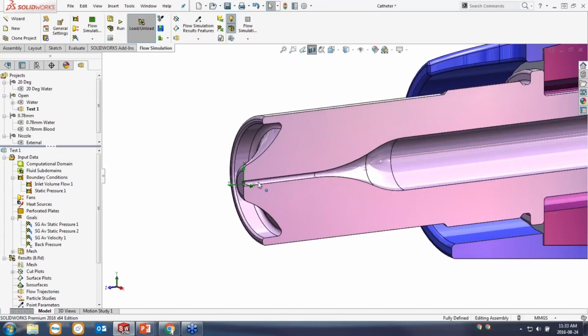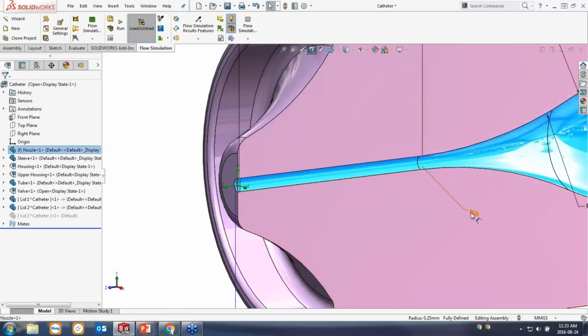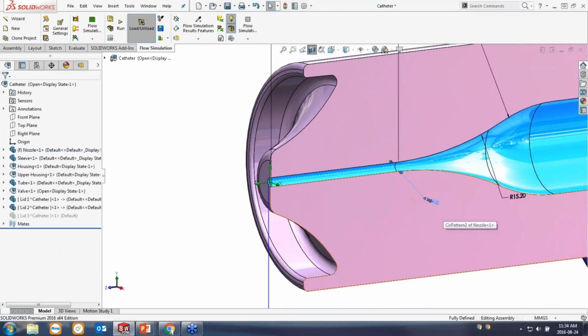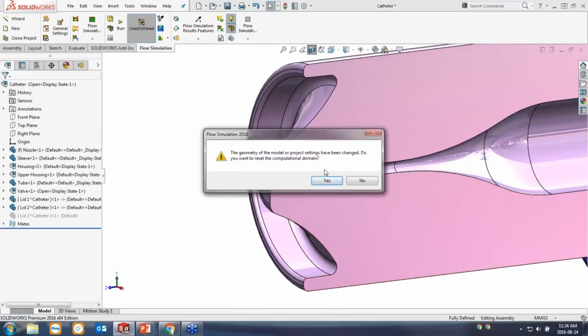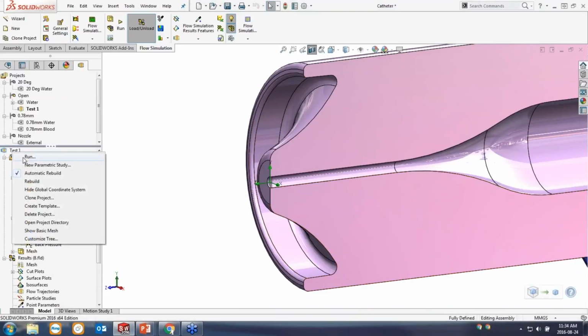And the great thing about this is, because I've built it into my CAD tool, I don't have to make a change to the model, export that and import that and go through this whole simulation process again. All I have to do is go back to the SOLIDWORKS tab, find the feature that I want to change. Maybe it's this 0.5. Take that dimension. Maybe let's try 0.6 millimeters. When I do that, it's going to update the geometry. Flow Simulation recognizes that it has been updated, so I can update my project, flip back to the Flow Simulation tab, and then simply hit run again. And then I'll have new answers.